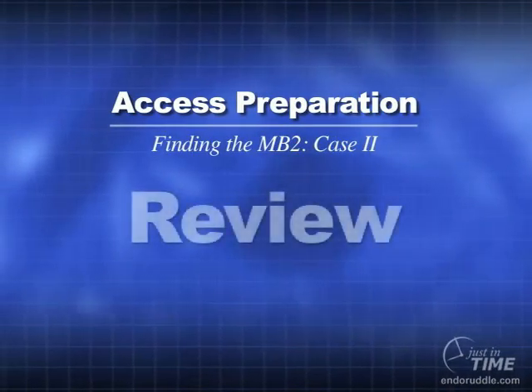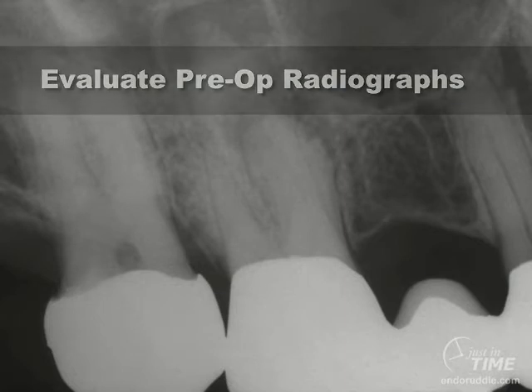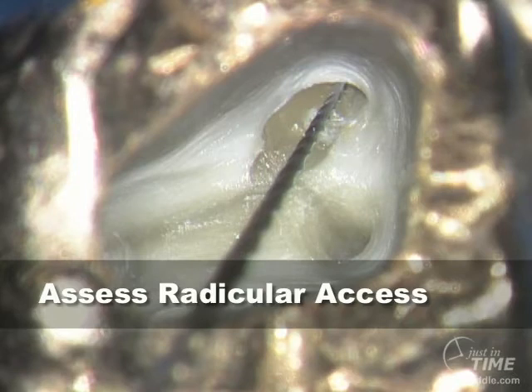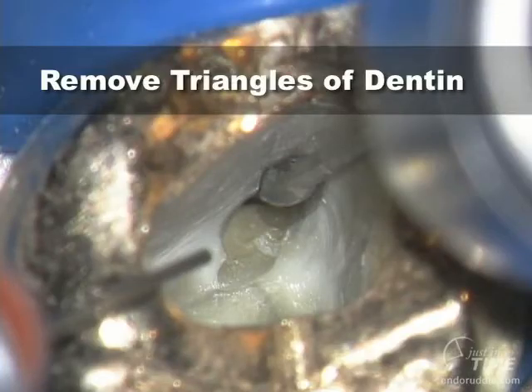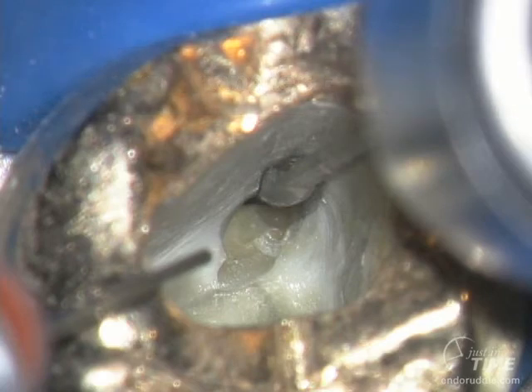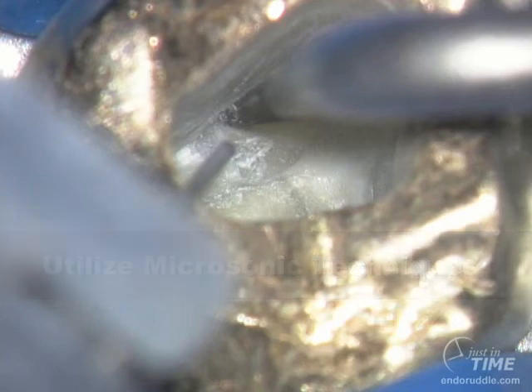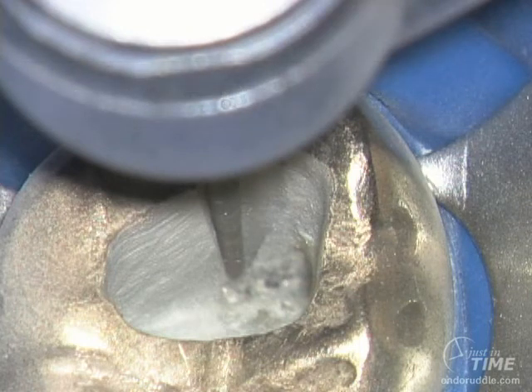Let's review how to find MB2 systems in maxillary molars. It all starts by evaluating multiple horizontally-angulated preoperative films. Check out your straight line axis — you either have it or you don't. If you're off axis, that'll dictate the next move: removing triangles of dentin. Ultrasonic techniques are very valuable by removing the bulky head of the handpiece to allow precise, detailed work. It is usual to alter the outline pattern to accommodate treating the MB2 system.